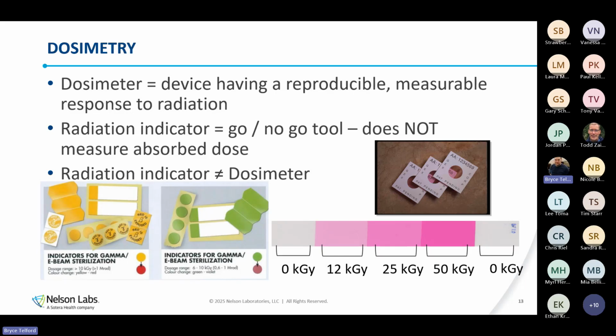And that radiation scanning, in order to scan the container and make sure there wasn't anything that shouldn't be in there, was sufficient to cause the red dot indicator to turn from yellow to red in their particular case. So red dot indicators are not necessarily the best indication of whether a product is sterile or not, just whether that indicator has been exposed or not.